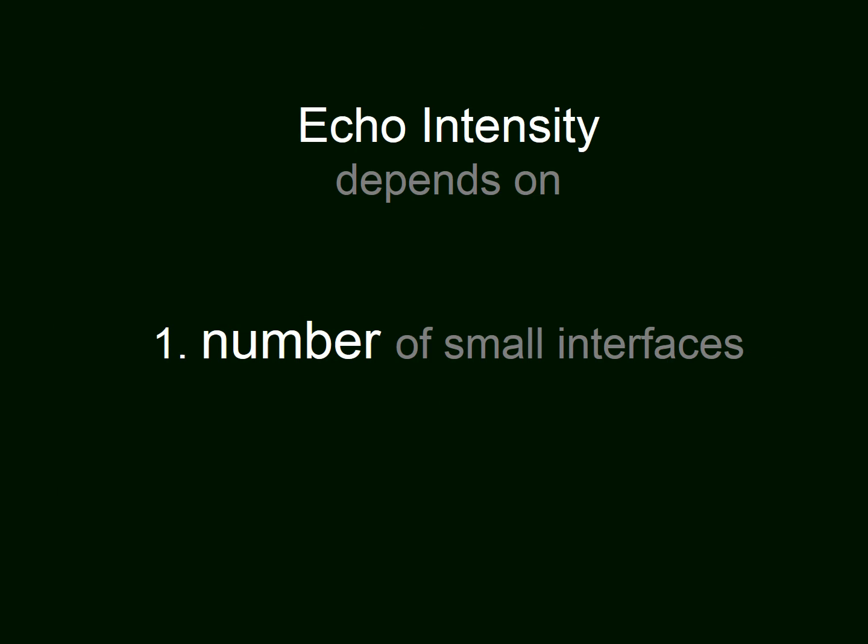Therefore, we know that the echo intensity from tissues, the reflectivity of tissues, depends on the number of small interfaces that are present.